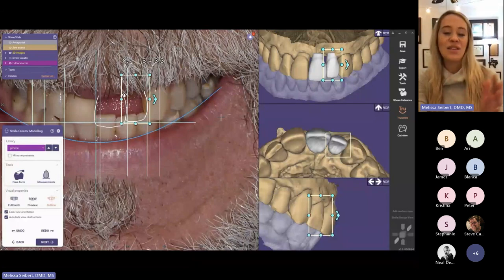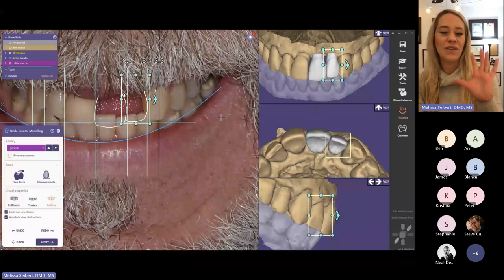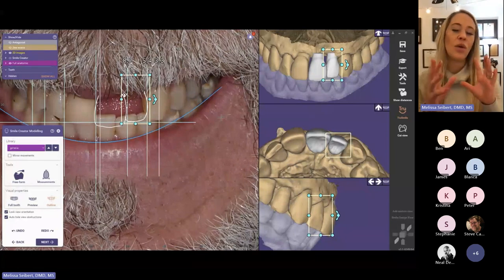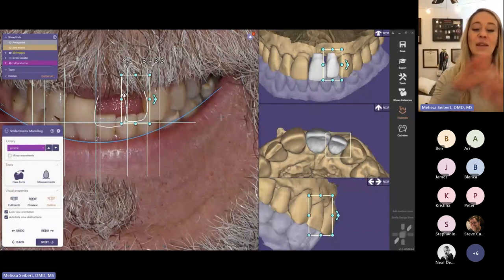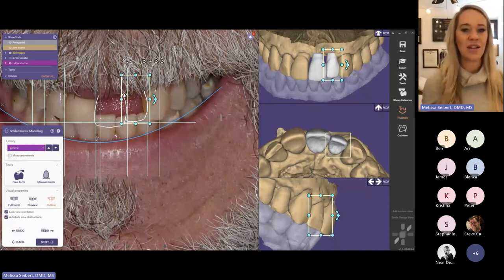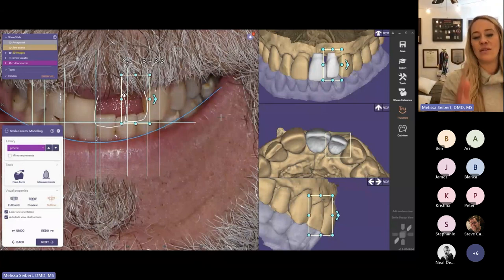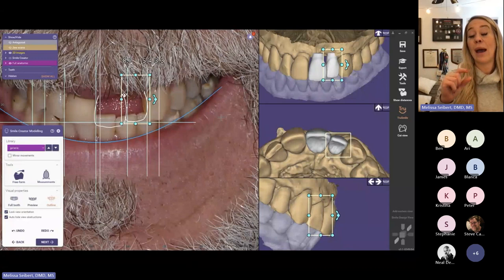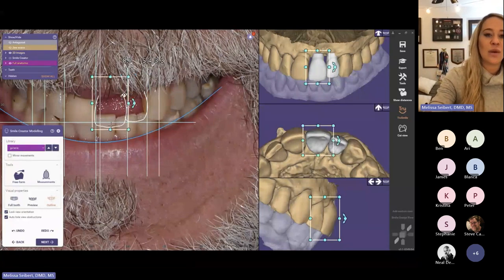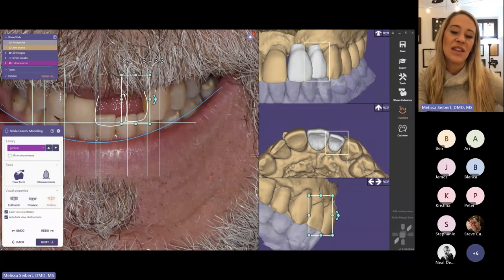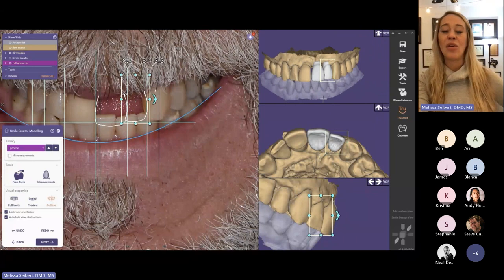I used the feature because it gives you a whole tooth library of different teeth. I initially placed one into the space of teeth 9 and 10. The benefit of the tooth library is that when you're working with a dental technician, they tend to use their own signature wax-up style. With a tooth library, we can leverage technology to go through different sets of teeth and identify what's most suitable for that patient. That's where we started — with the tooth library — and the patient got to give input and see how we were positioning the teeth. One challenge with this case is that he's been missing these teeth so long that we don't quite have the same amount of space we'd ideally like.